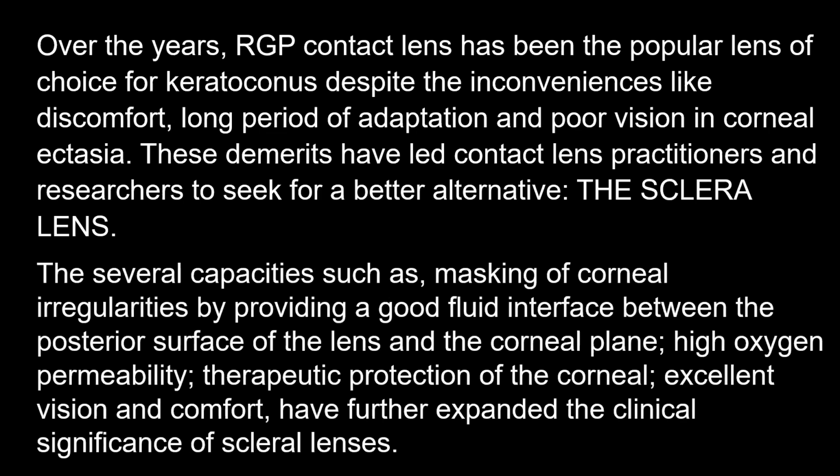So there are other indications, there are other cases where patients have RGPs on their eyes, but they keep falling off, they keep dropping off. And in such cases, the patients cannot wear them for a long time because they keep falling off. So now the thinking is that something that can cover the whole of the cornea properly, that won't fall off easily, that will give optimal comfort, and at the same time will be suitable and stable in the eyes. So that gave rise to scleral contact lenses.